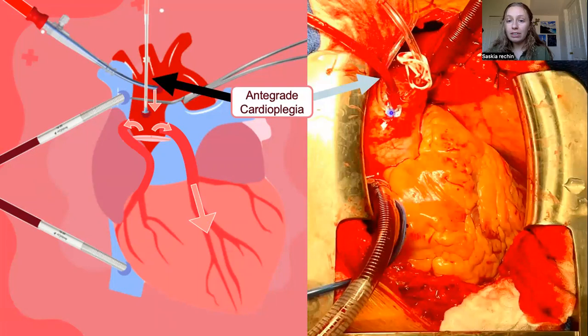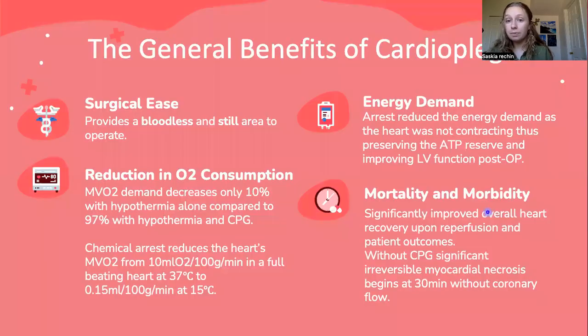You can have your antegrade needle here. Here's your vent where that needle's placed. You have enough room for the cross clamp so that it will be delivered at a high pressure, slamming the valve closed and arresting the heart.